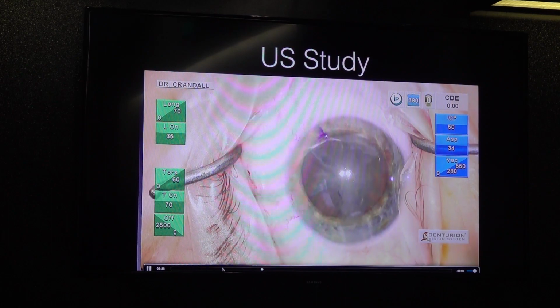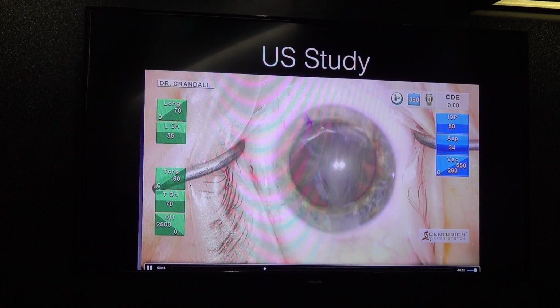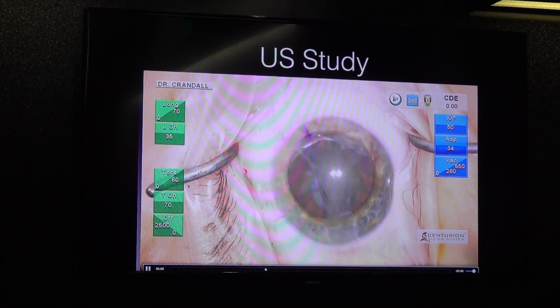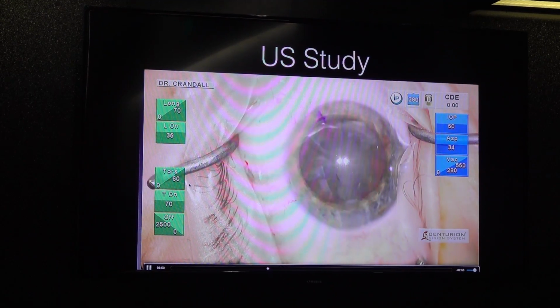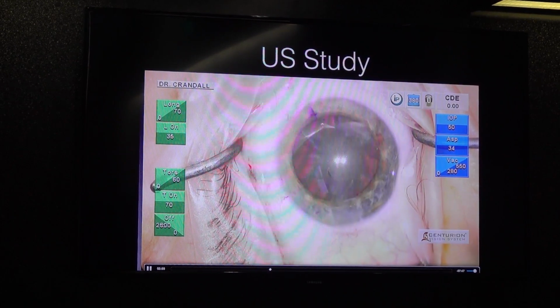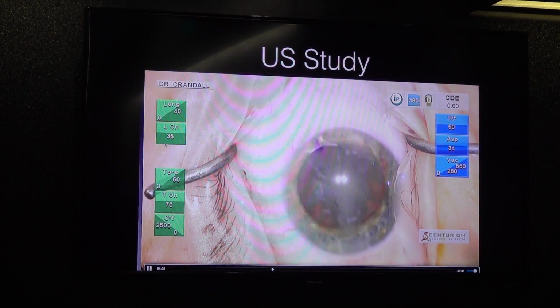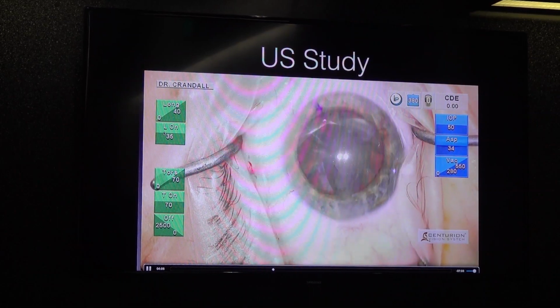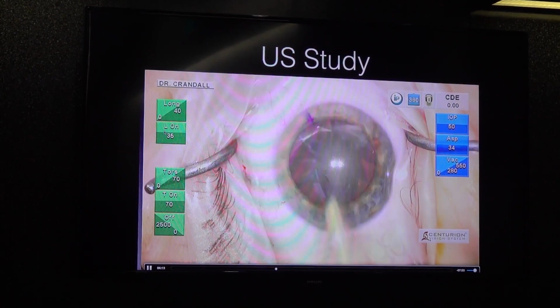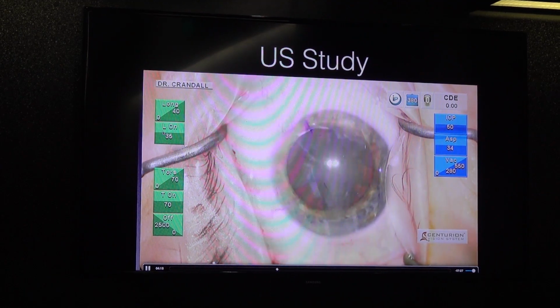And then the other thing we'll do, you'll see over here, is when we get the whole study done, we're planning on about 400 patients, so it should take us about a year to finish the study, because not all patients are eligible for it. Then we'll look at different time on, time off. If you do burst modes, or we have torsional and longitudinal and short times, there are multiple studies out there that show that it doesn't make a huge difference about the time on, time off in torsional, but it does in longitudinal.